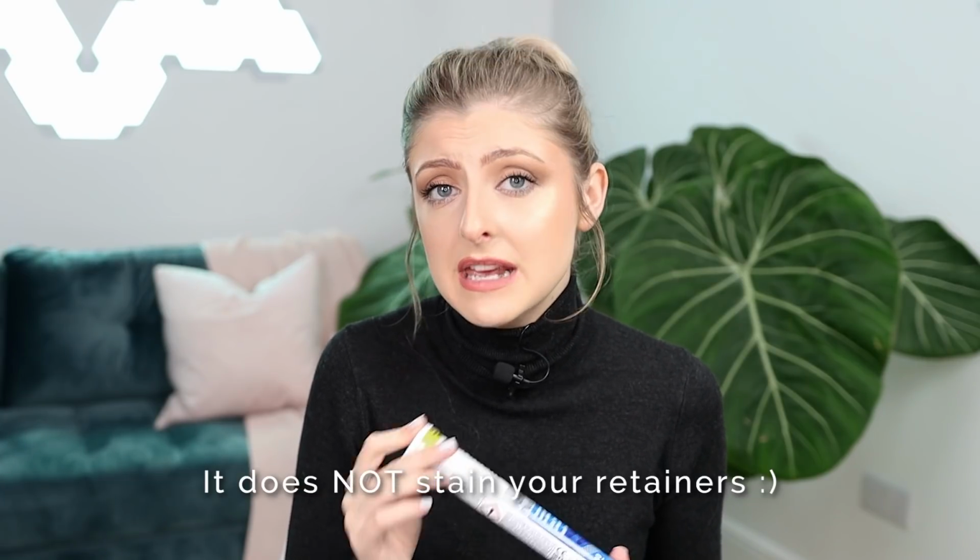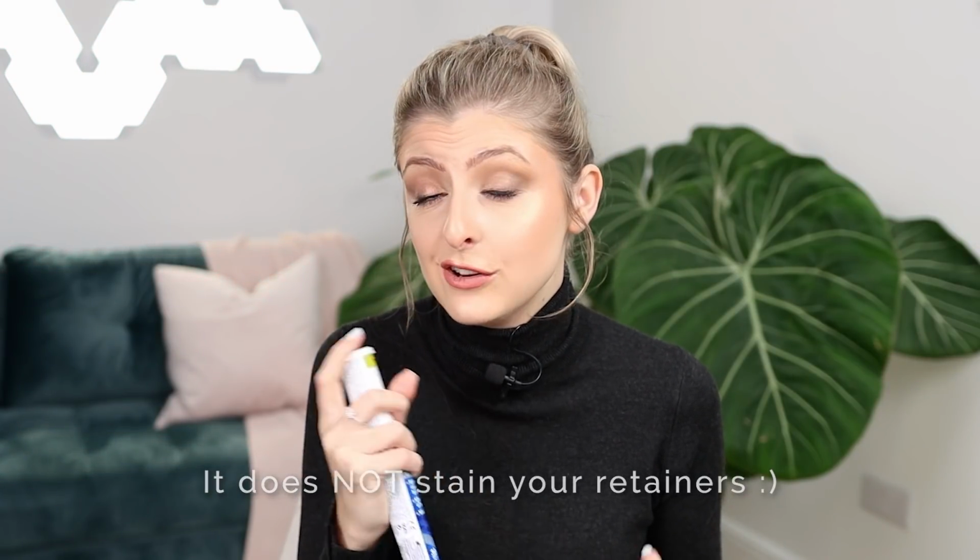So if you're eating a meal and you want to clean your retainers, because you have to take them out, then drop it into a glass with this. Very helpful. There are some things, I'll quickly go into now, about the things I actually have to carry around with me. I don't know where my mouthwash went. That's gone walkabouts. But I did have a small bottle of mouthwash.